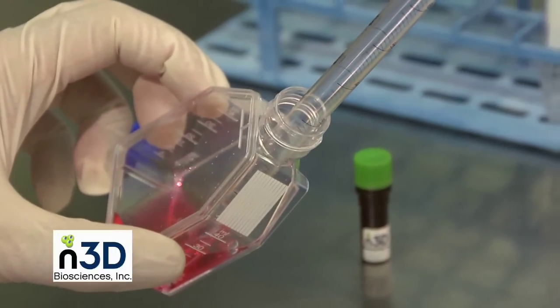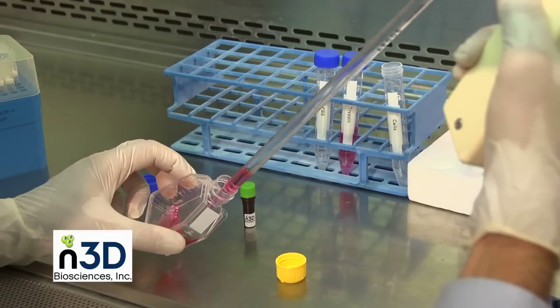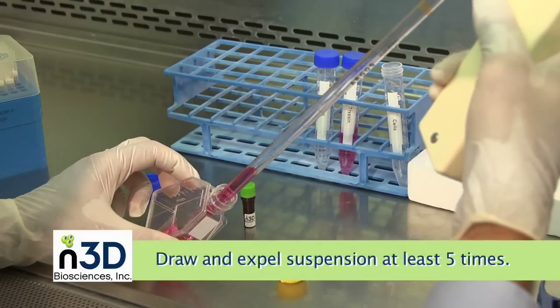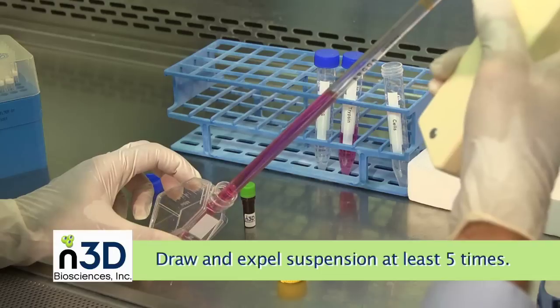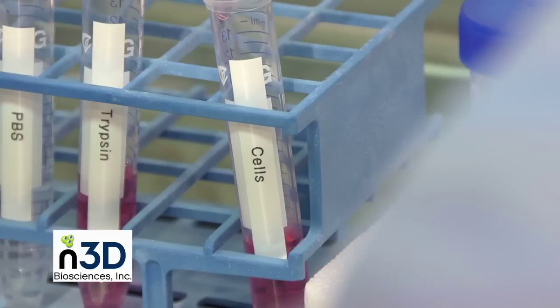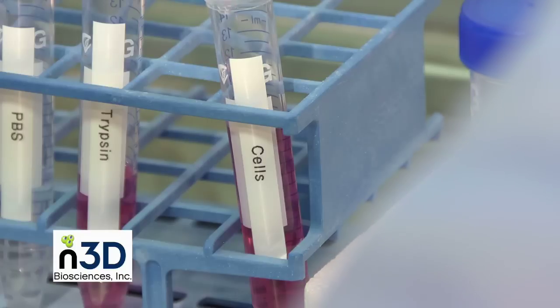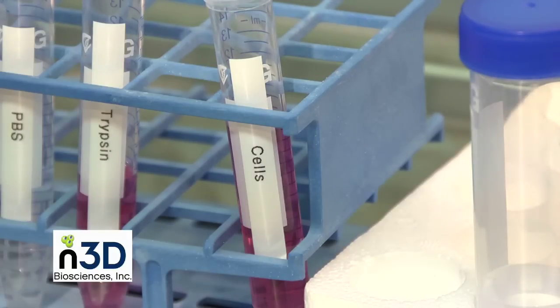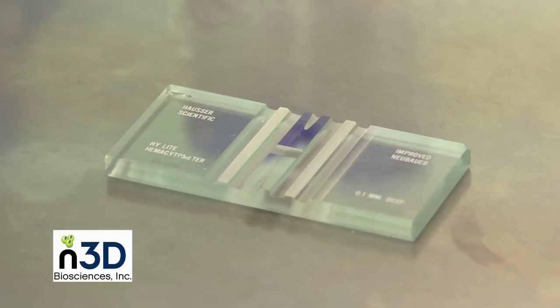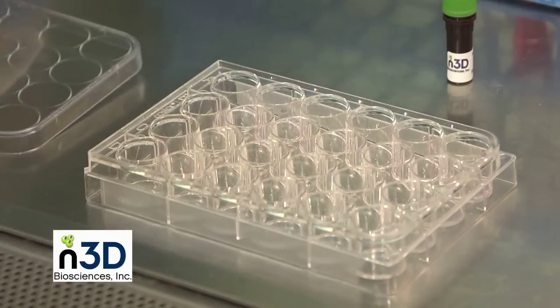Now draw the cell suspension with a sterile pipette. Expel the suspension back into the flask to rinse the inside surfaces — repeat at least 5 times. Check again under a microscope to ensure the cells are in suspension. Redraw the entire cell suspension into the pipette. At this time, the cells should be counted. If needed, dilute or concentrate detached cells to obtain the desired cell concentration.